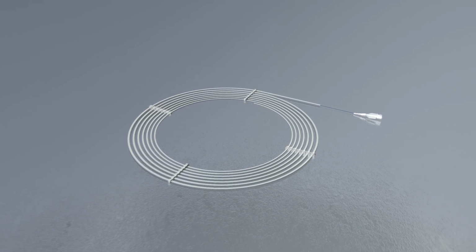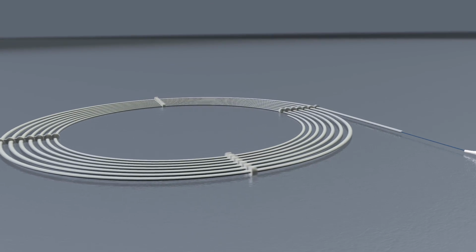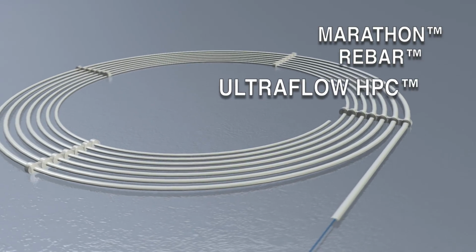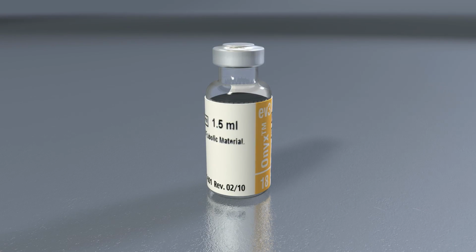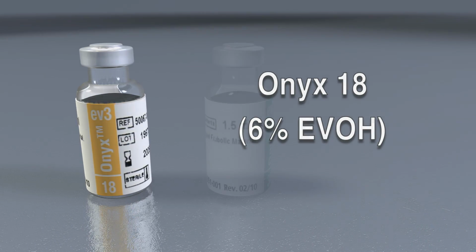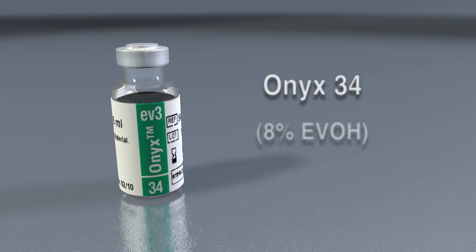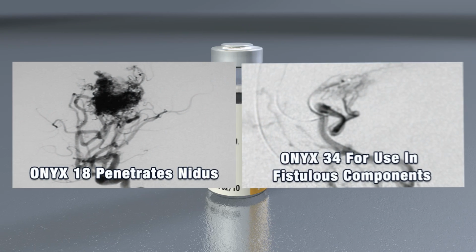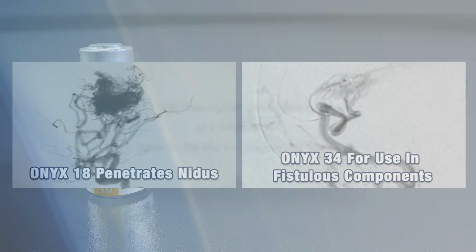A DMSO-compatible delivery microcatheter indicated for use in the neurovasculature, for example the Marathon, Rebar, or Ultraflow HPC catheters, must be used to access the embolization site. ONYX is available in two product formulations, ONYX 18, 6% EVOH, and ONYX 34, 8% EVOH. ONYX 18 will travel more distally and penetrate deeper into the nidus due to its lower viscosity compared to ONYX 34.